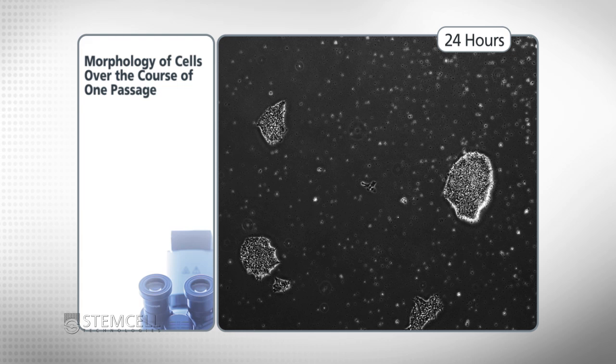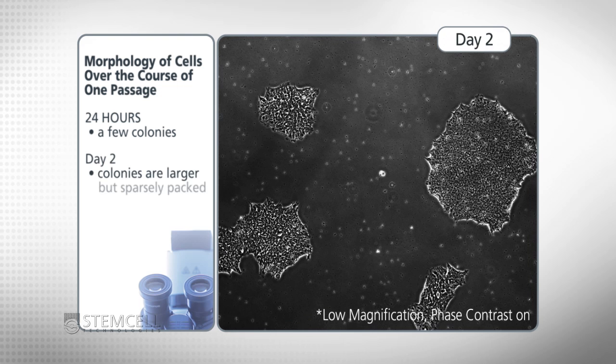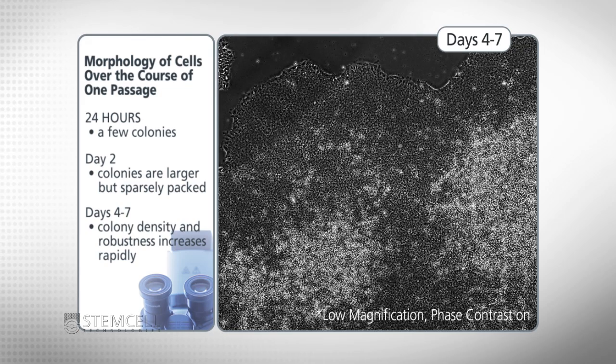When viewed under low magnification and phase contrast, we see a few colonies forming within the first 24 hours after seeding. In the following two days, the colonies become larger in size but are still sparsely packed with cells. At days four to seven, the density and robustness of the colonies increases rapidly, and you'll see significant changes in their morphology immediately before they're ready for passaging.